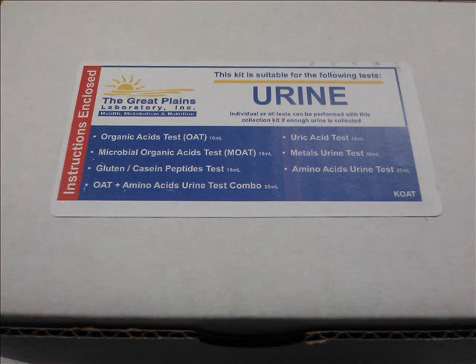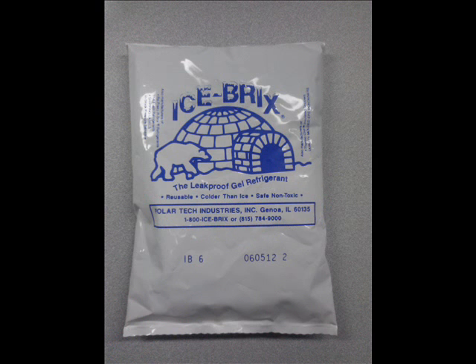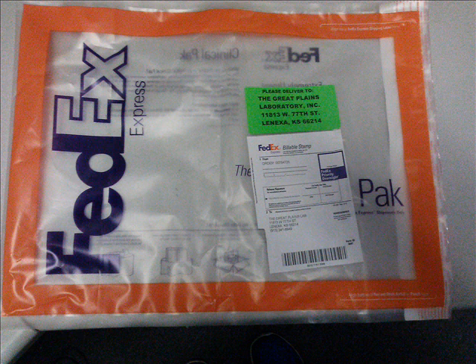You should find the following items inside the box: one plastic urine cup, one freezer ice brick, one Ziploc specimen pouch, one silver U-line envelope, and one white absorbent square.